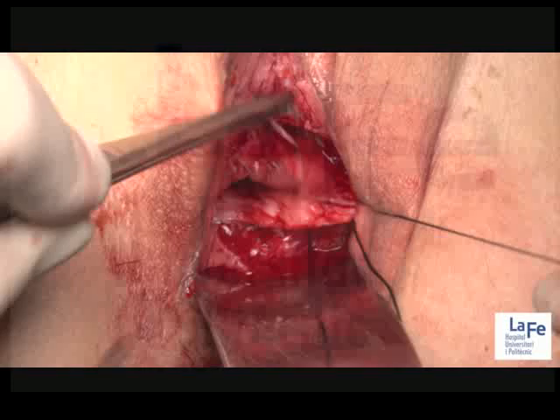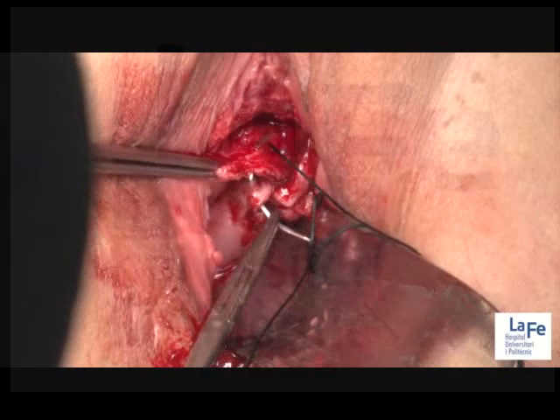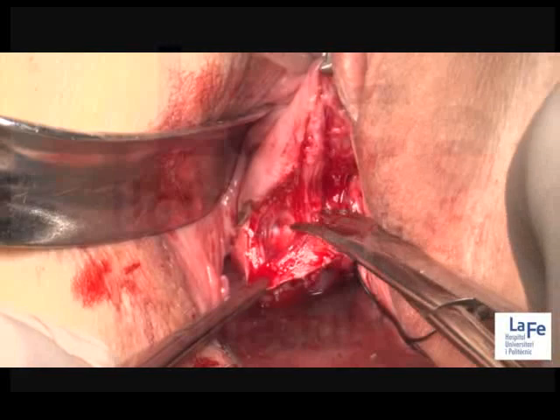After the LACC publication, the laparoscopic approach of surgical treatment for cervical cancer has been called into question, the open approach being the most recent recommendation for radical hysterectomy to date. Nevertheless, there are some concerns about the laparoscopic approach that remain unresolved.